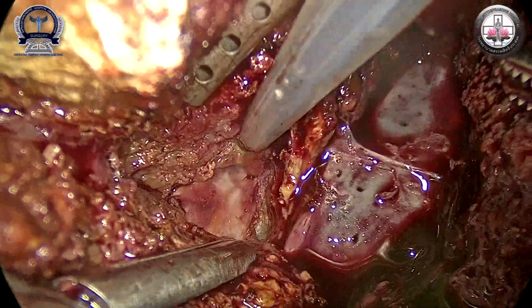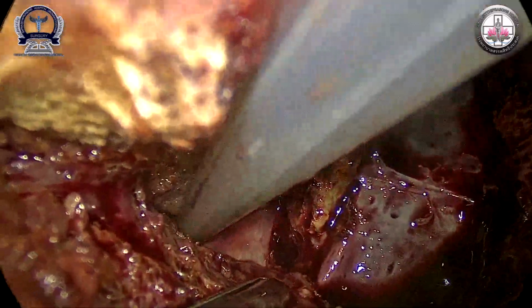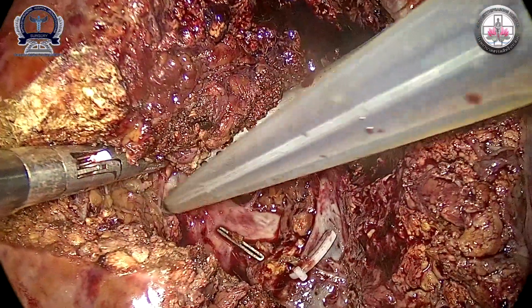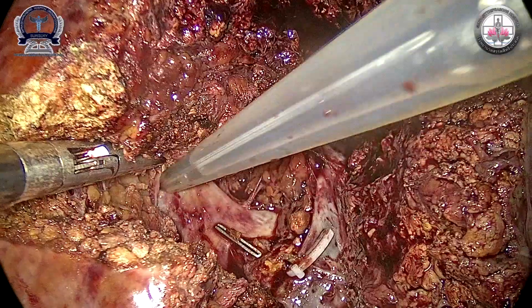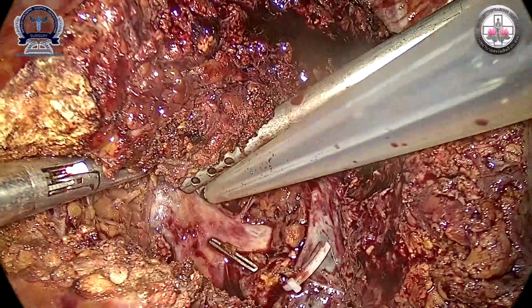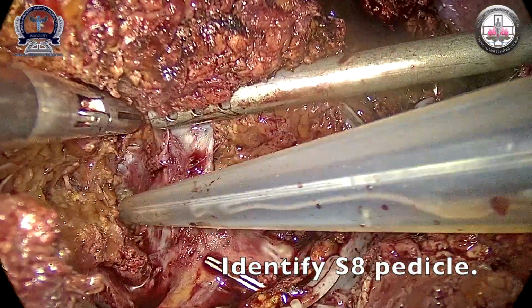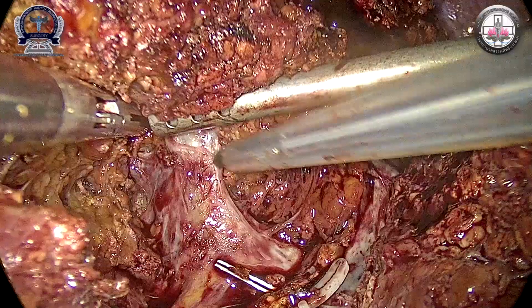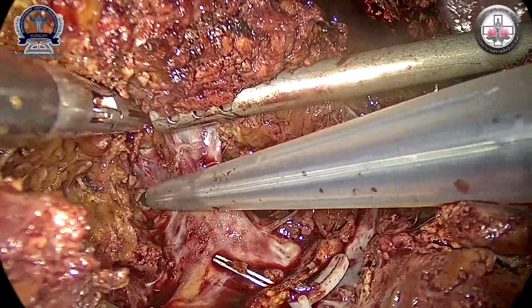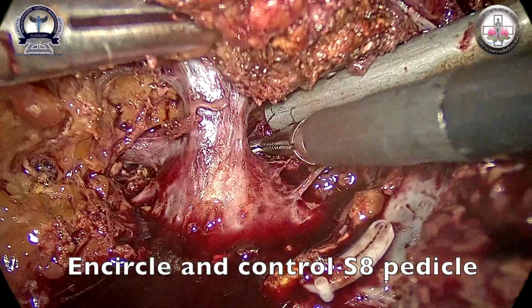Parenchymal transection was performed along the right anterior pedicle to identify the segment 8 pedicle. Then, the pedicle of segment 8 was controlled.